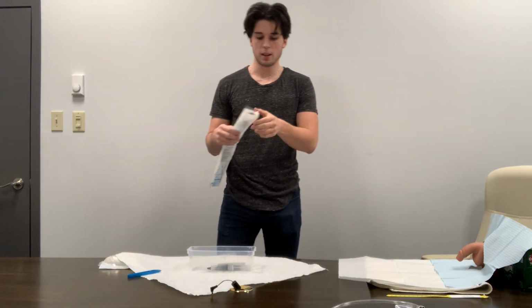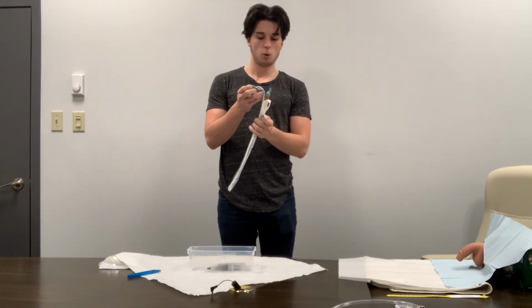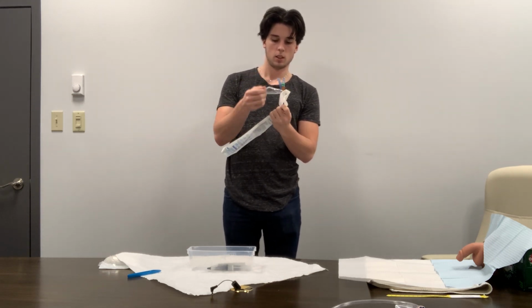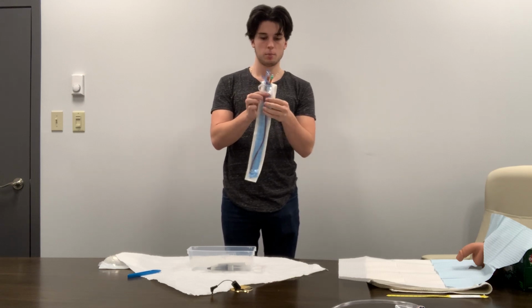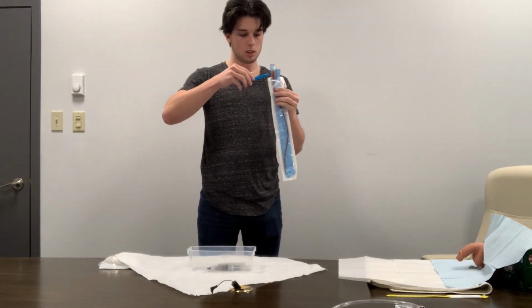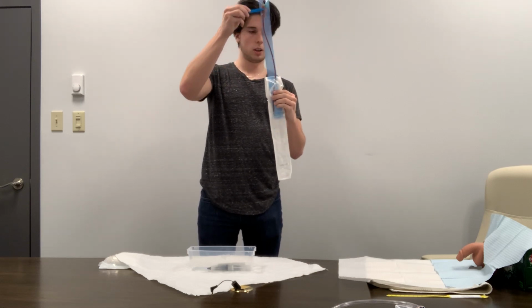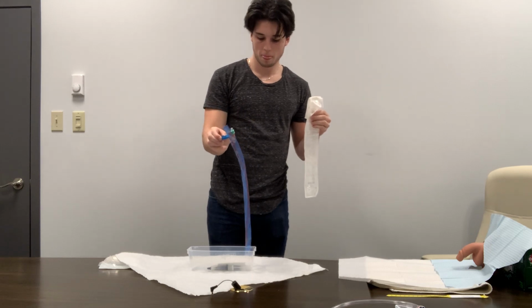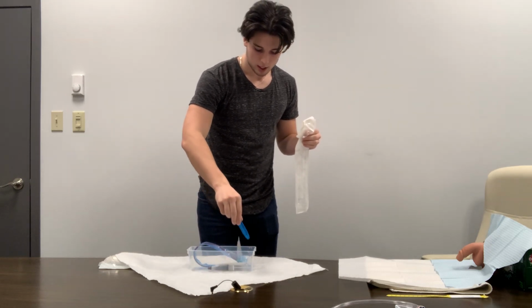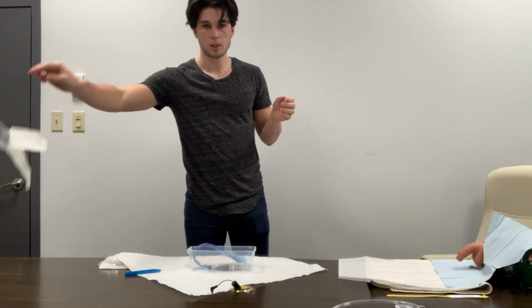So we would grab our catheter, and maintaining sterility as the blue package inside is sterile, we will be opening our catheter, grabbing our blue forceps, and we will be grabbing the catheter itself and pulling it out and placing it into our boat. So once that is placed into our boat, we can set aside our forceps and throw this right in the garbage.